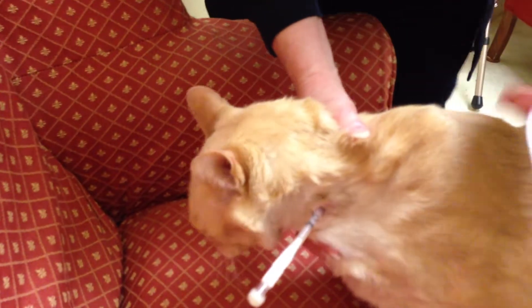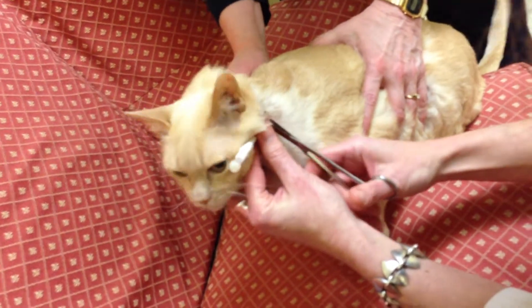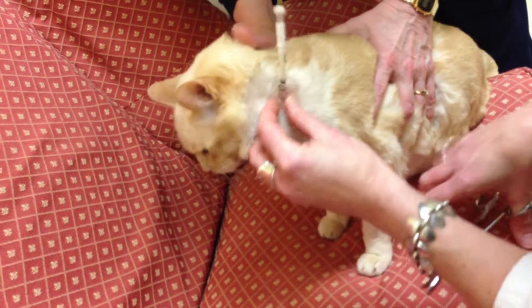Come on, hold still. Hey, Alexander. Here's the scissor rubber. Thank you. Let me turn him a little bit this way. That's perfect. That's a good boy. I know, you're purring.